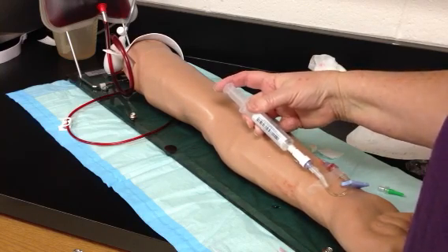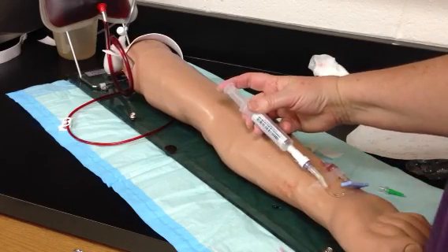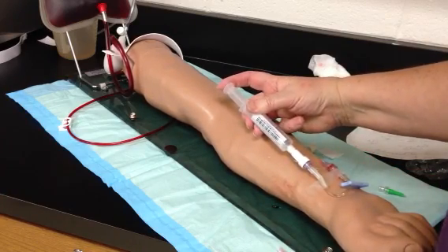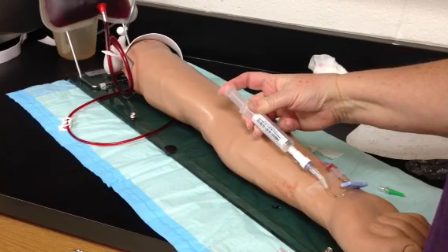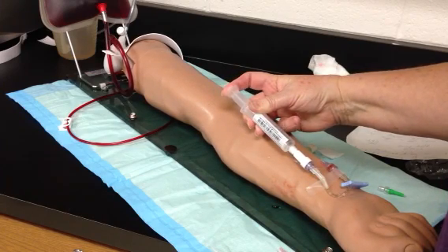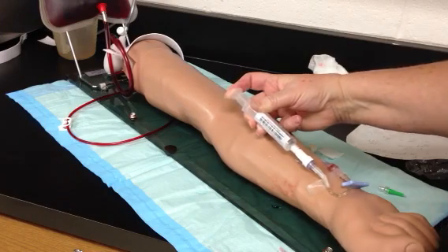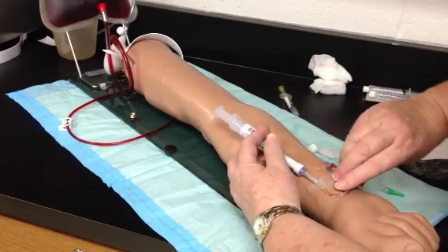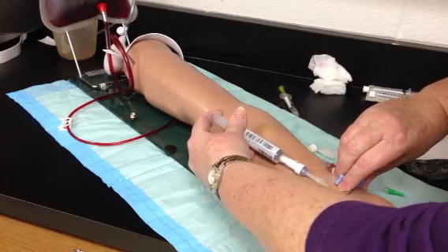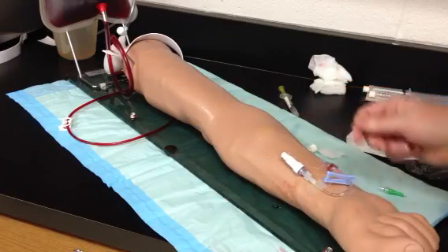After I've pushed a milliliter of saline, I know at that point that I've cleared out my loop with medication, and I just have saline left in there. I can go ahead and push my other 2 milliliters of saline just at a usual slow rate. As I'm pushing, then I want to lock off, be pushing a little bit, lock off before I disconnect.